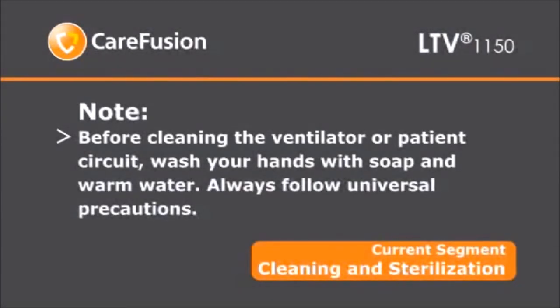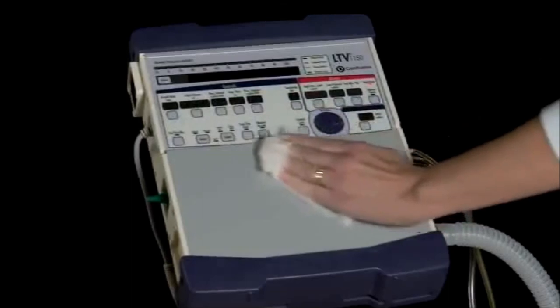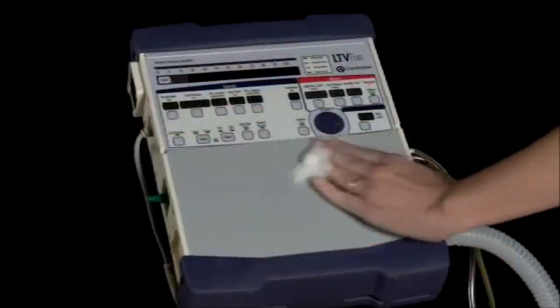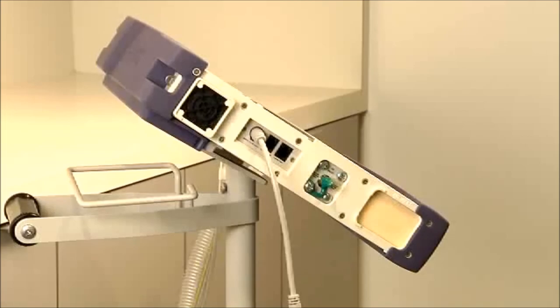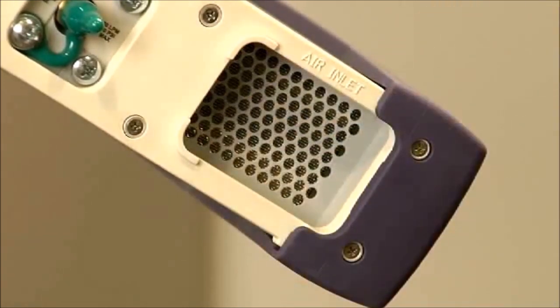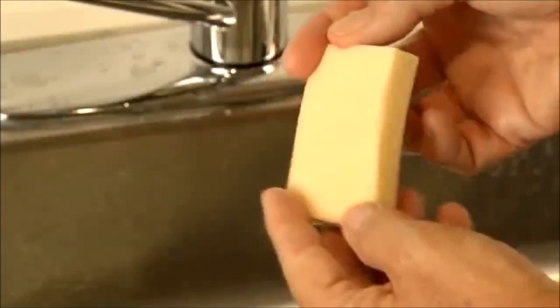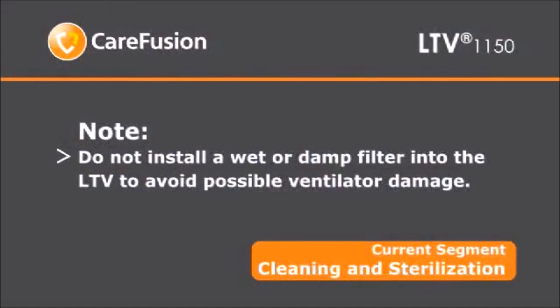Before cleaning the ventilator or patient circuit, wash your hands with soap and warm water. Always follow universal precautions. Clean all external surfaces of the ventilator prior to initial use and after each patient use and whenever necessary. To clean the ventilator, wipe the exterior surfaces with a clean damp cloth with an appropriate bacteriocidal or germicidal agent. Follow the cleaning agent manufacturer's recommendations regarding contact time. The inlet filter is located on the lower left-hand side of the LTV 1150. Remove the inlet filter by gently pinching the foam filter and pulling it out. Hand wash the filter using warm water and a mild liquid detergent. Rinse with warm water. Inspect the filter and replace it if necessary. Allow the filter to air dry before reinstalling it. Do not install a wet or damp filter into the ventilator, as this could damage it.